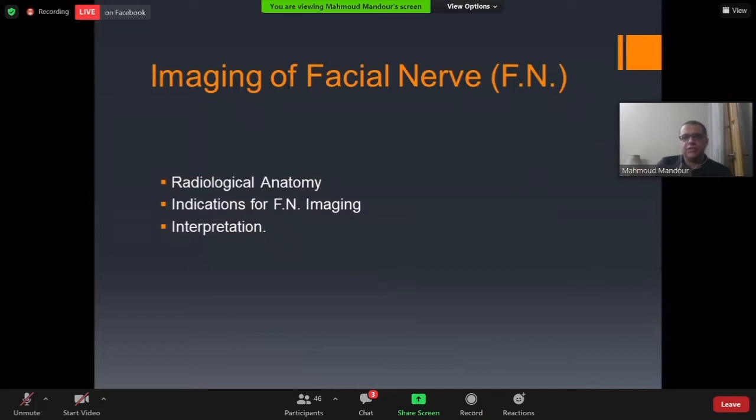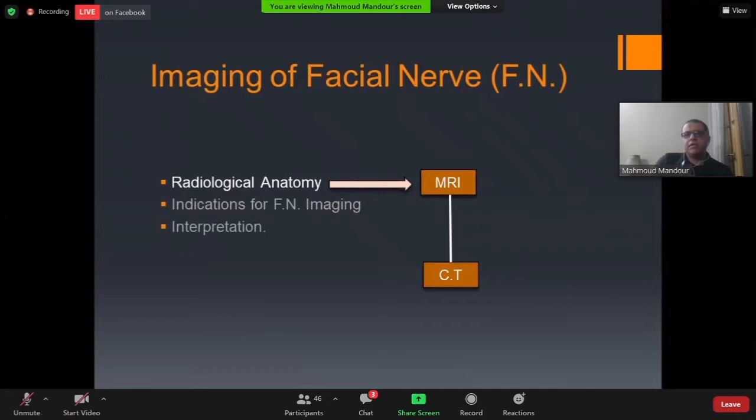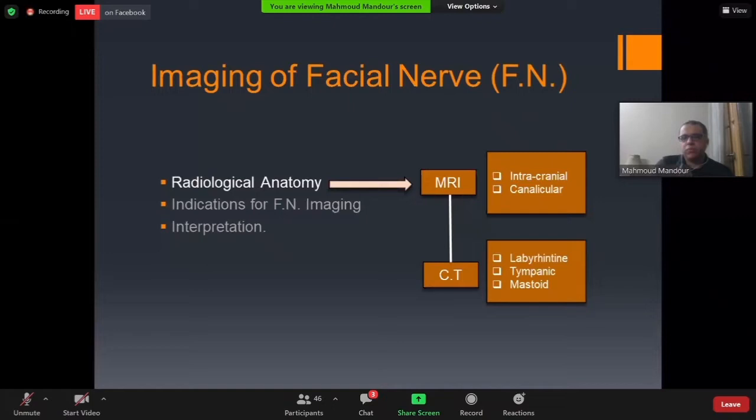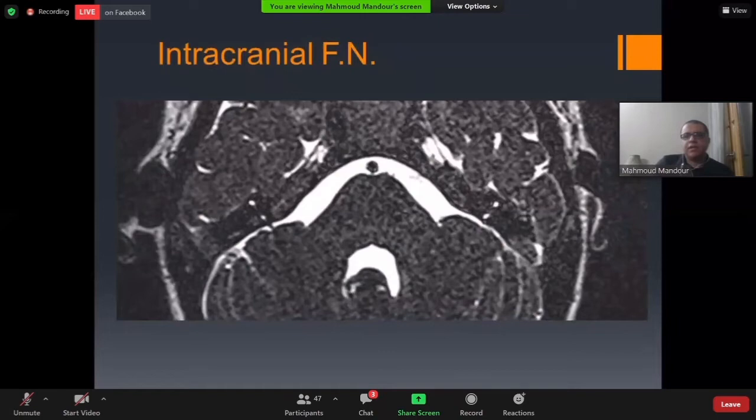When talking about radiological anatomy, we have two modalities for radiological evaluation of the facial nerve: MRI and CT. Roughly, MRI can be used to evaluate the intracranial and intracanalicular part of the facial nerve, while CT can be used to evaluate the intratemporal part of the facial nerve within the temporal bone, including labyrinthine, tympanic, and mastoid segments.